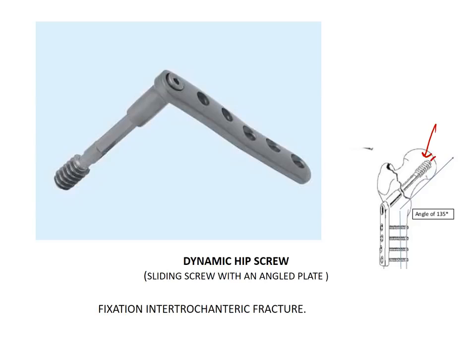Tip apex means the distance between the head of the femur, the articular margin, and the tip of the screw. If it is appropriate and it's holding onto the strong, deeper bone, this is a very stable fixation. It was classically called as a treatment of choice for intertrochanteric fractures. But as the science evolved, this surgery had complications which were discovered.